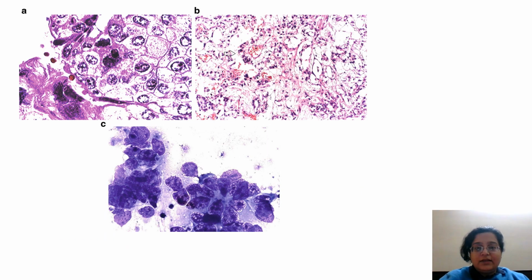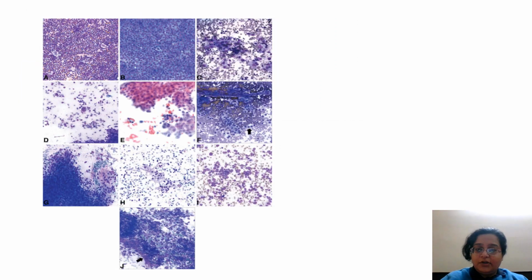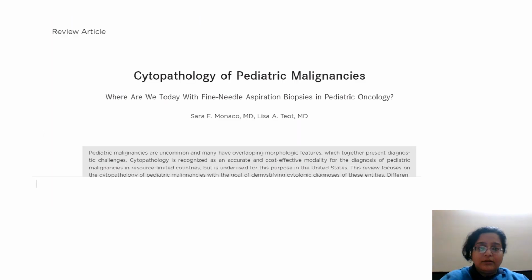Again, these are clear cell. This is a Schiller-Duval body. So this is more of a germ cell tumor. You'll get vacuolation and these pleomorphic nuclei or maybe clear cytoplasm, and then you correlate with the radiology. Then this is a spectrum of the small round blue cell tumors I've already taken. This is the article that I was talking about.